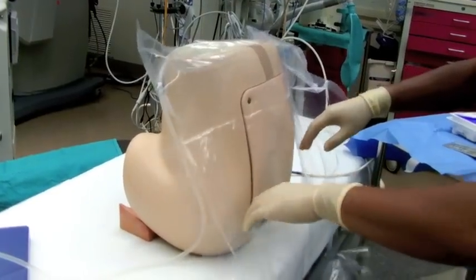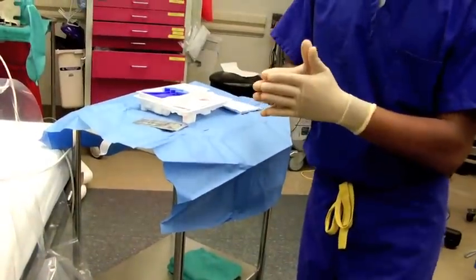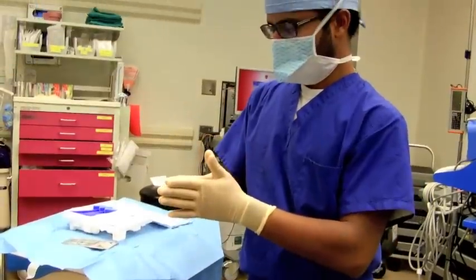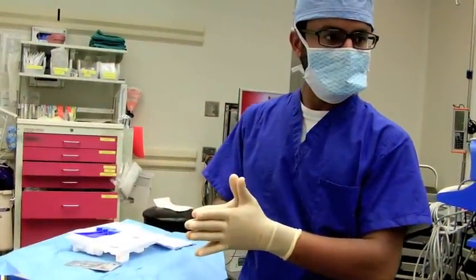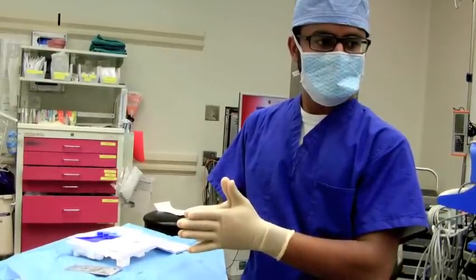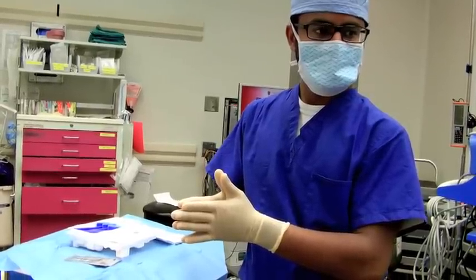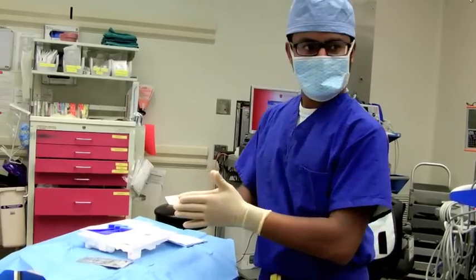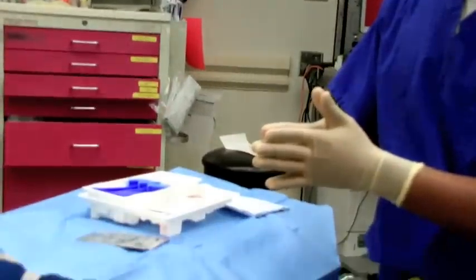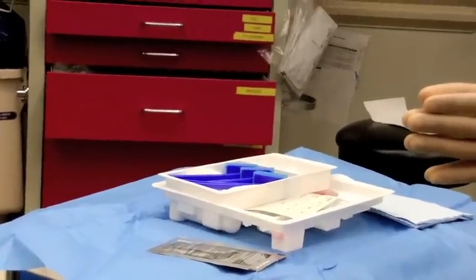Verify the content of the anesthetics before drawing it up. Draw up lidocaine in a 3 cc syringe and bupivacaine in the 5 cc syringe. Warn the patient that you are about to administer local anesthesia. Re-identify the intended interspace after the patient is prepared and draped. Using the smallest provided needle, make a wheel of local anesthesia at the previously marked site. Ask assistant to add morphine to your bupivacaine syringe.